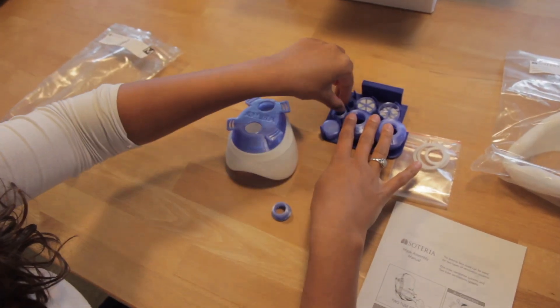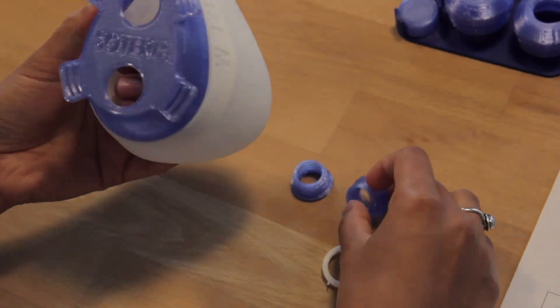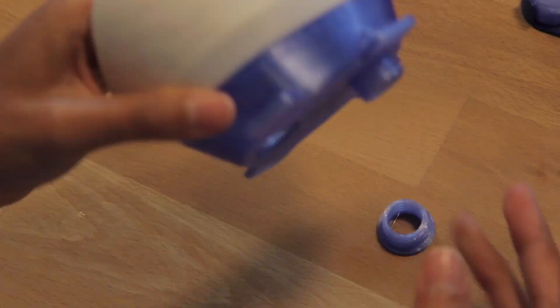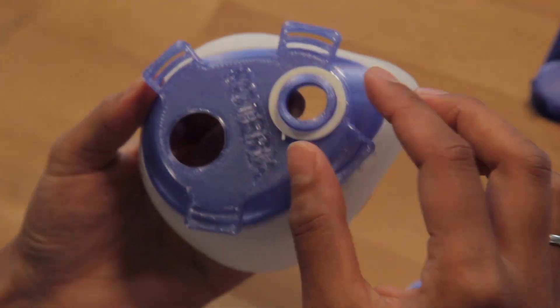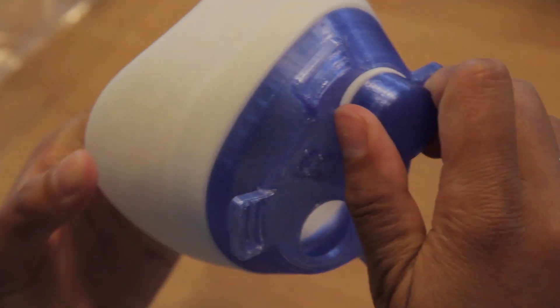First, take the two connector pieces and the sealing rings and insert the connector pieces into the Soteria face mask from the back. Add the sealing ring on the outside and screw the plug on the outside of the connector piece.